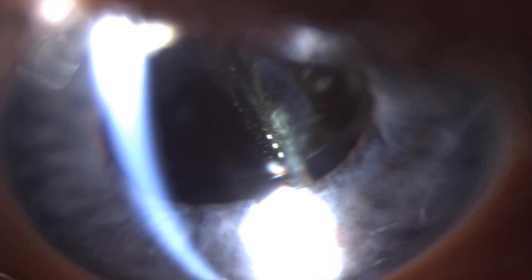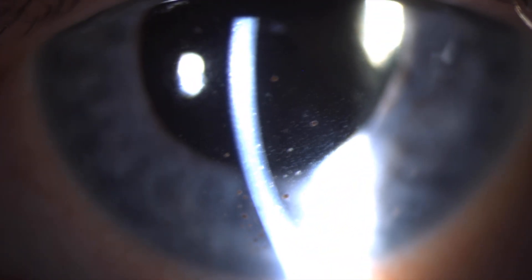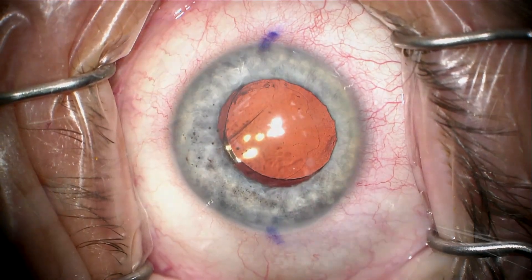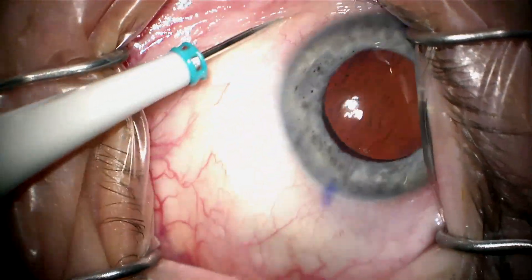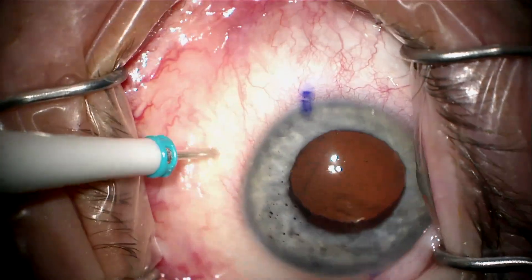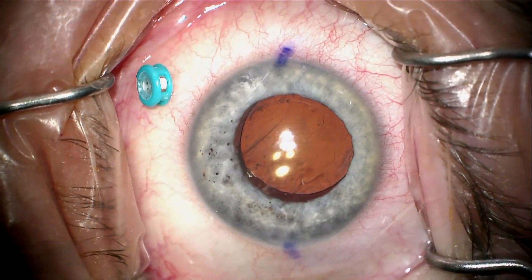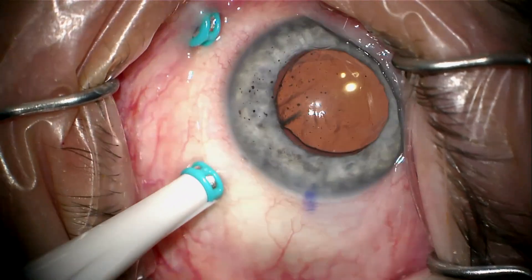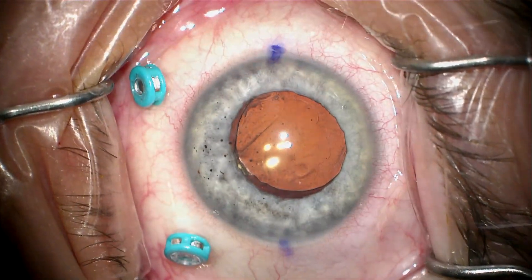There is vitreous traction — you can see the vitreous pointing inferiorly. The iris is stuck to the anterior capsule, and there are inflammatory deposits on the back of the cornea. The goal is to perform a pars plana vitrectomy and bring this iris down with a cerclage so she's not stuck with all this glare.